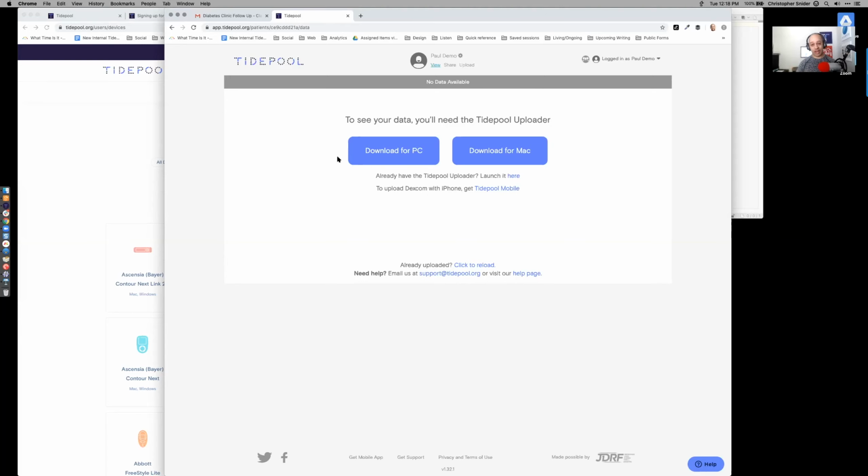I'm going to figure out what happened with Tidepool Uploader on this past issue. Again, I'm going to send an email to support@tidepool.org to figure out what happened there. And from there, tomorrow we're going to walk through Tidepool Web and show you all the different views: basics, daily, BG log, and trends, and show off everything we have there. That way you have a basic understanding of what you can expect once you successfully upload your data to your Tidepool account. So we have a couple of questions coming in real quick.